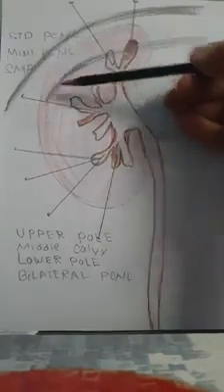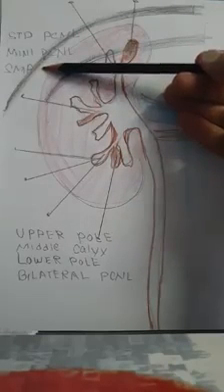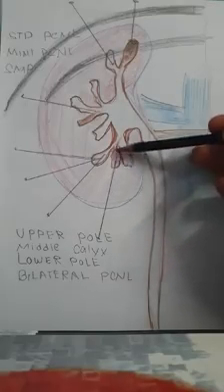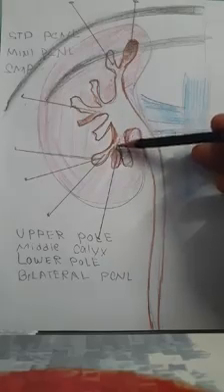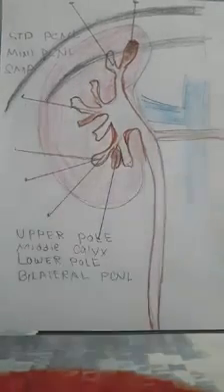So when I'm using an inferior pole, I always use the super mini technique, because it's very nice, because it also has a suction effect, and it always uses laser, and there is no chance of stone migration, because the fluid will just push back, as there is a suction mechanism together with this.